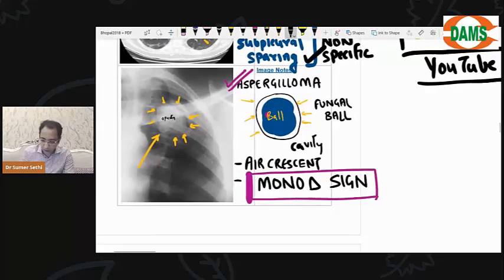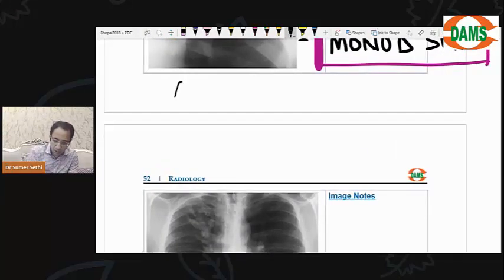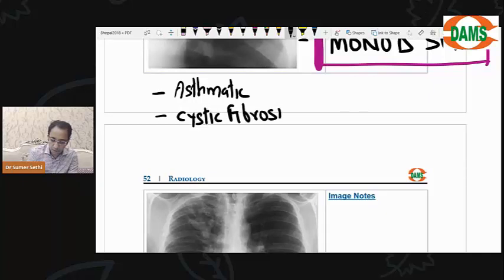Now let's see if you can answer better. Okay, let's try to understand and answer. Suppose a patient is asthmatic or somebody has cystic fibrosis. Okay, suppose a patient is asthmatic or has cystic fibrosis.